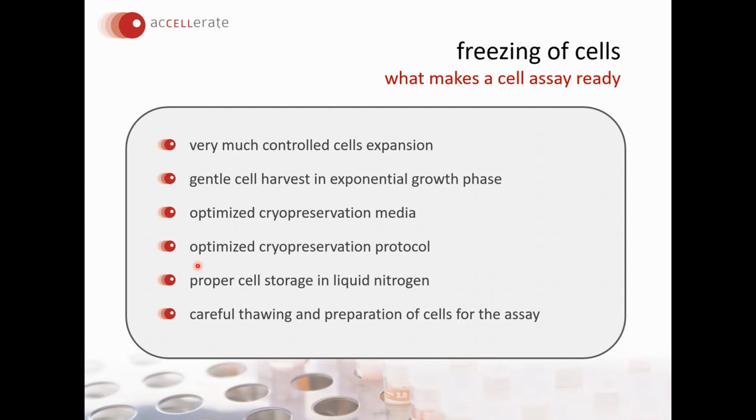The most important point, of course, is the cryopreservation process itself. So there's always a need to optimize the cryopreservation media. There's definitely no one-fits-all media which works the same for all cell lines and all cell types. And also the optimization of the cryopreservation protocol has a significant impact. I will come to that later.